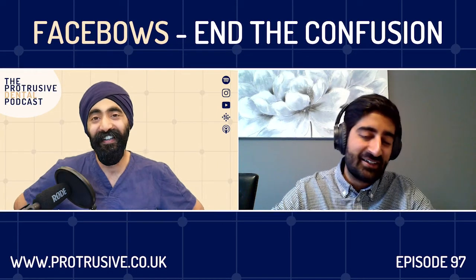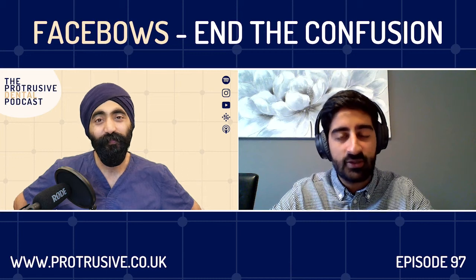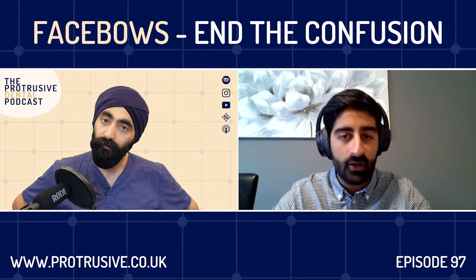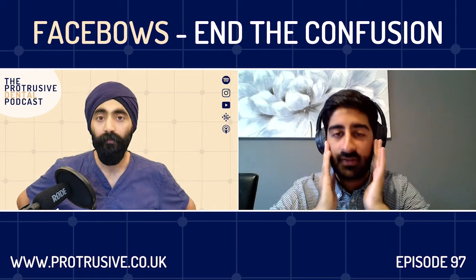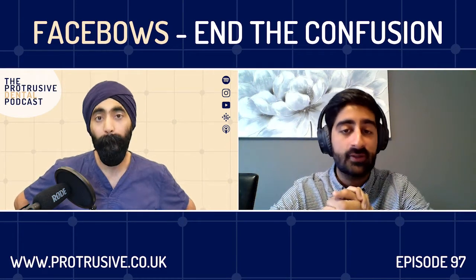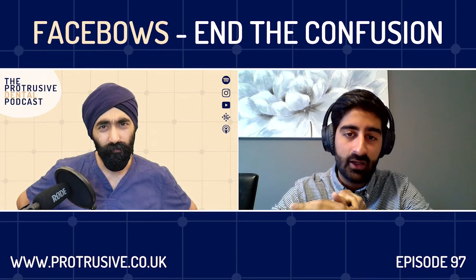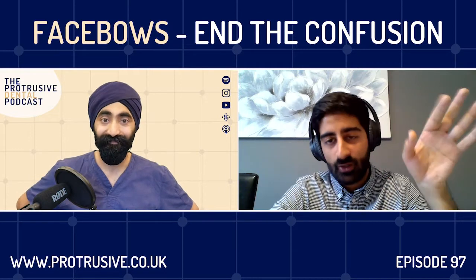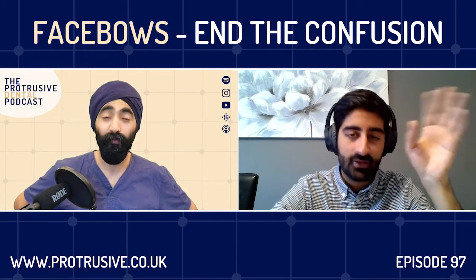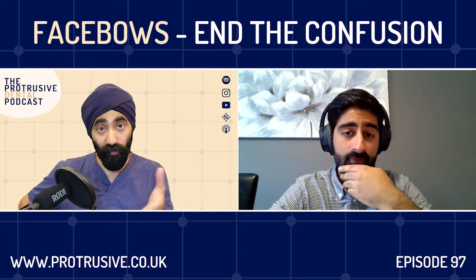Very true. Okay, the second type of articulator is like a fixed average movement articulator, which just has general averages that work for multiple patients who have been assessed, or the angles have been put into this articulator, and you mount your casts on there. Now that articulator doesn't accept a Facebow record. You position the casts on there either just randomly, or there's certain parameters that you can mount it using, which I can discuss if you'd like to. While we're on that topic, let's go into that.